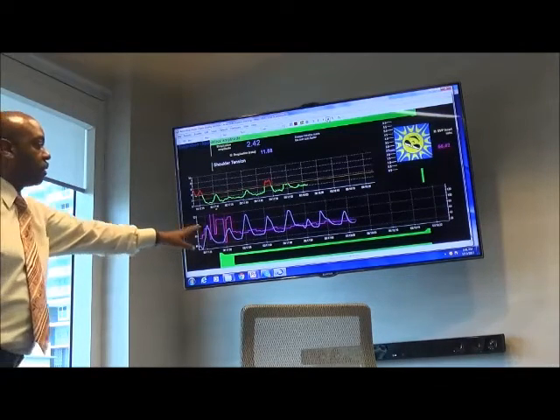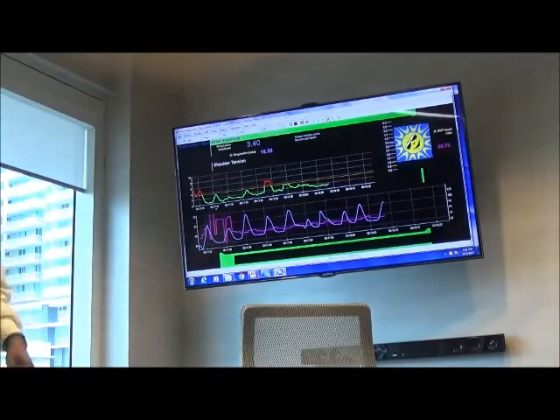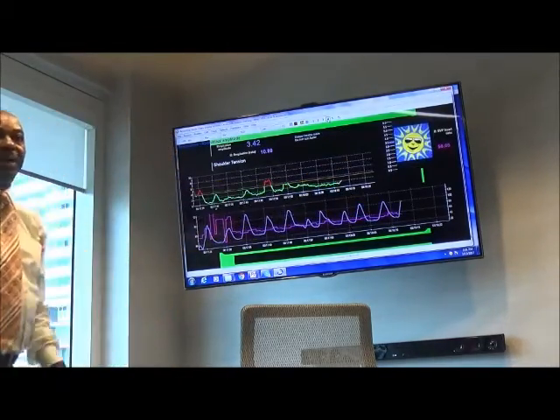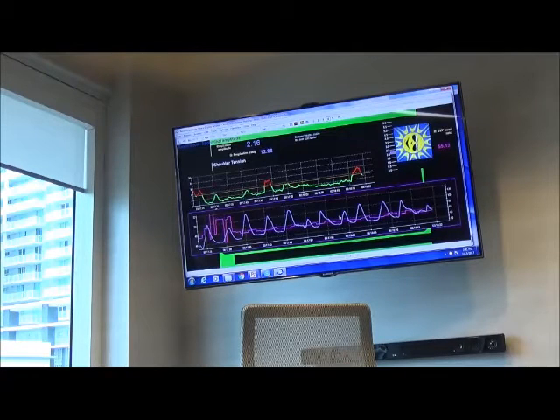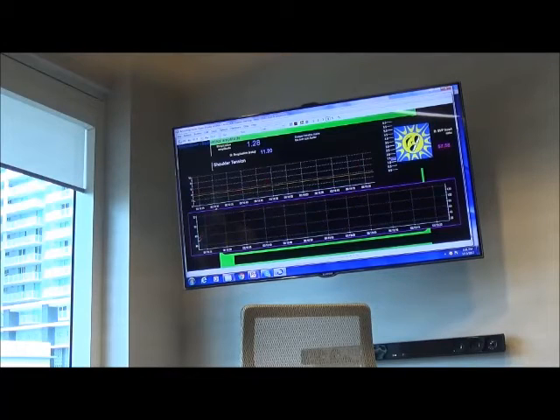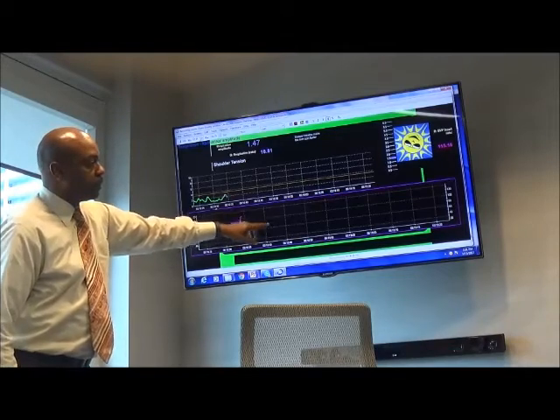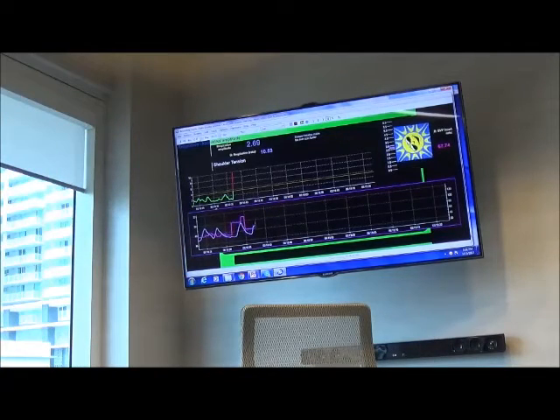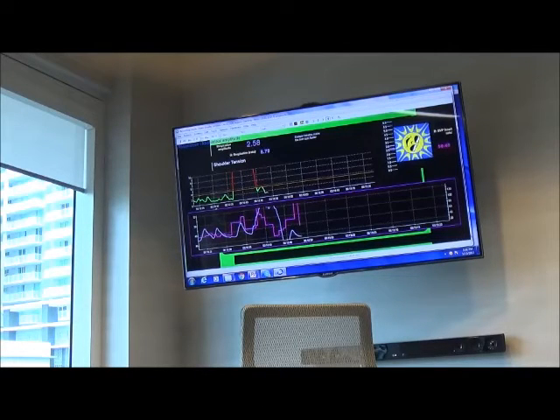And here we might adjust the heart scale so that we would want the other side if we want to adjust for the heart because it's showing from 20 beats per minute up to about 130. So it's too wide. So you can look to see if it's on the scan. So this is heart and you see about where the signal is. So you can decide what you want for minimum and maximum. So you have to decide if this is heart or this is breath. You have to know which is which. The blue is breath. And that's heart. Good job.